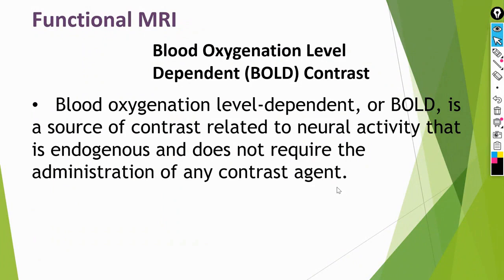Take this as a rule. The more advanced or powerful your MRI device is in terms of magnetic field, the more it initiates a difference in the precession frequencies between different atoms, making the difference in precession appear more clearly between the different atoms present. That's why I cannot perform MRI spectroscopy on a basic device. I can't, for example, do the imaging. I can't do this in bold on an open device.